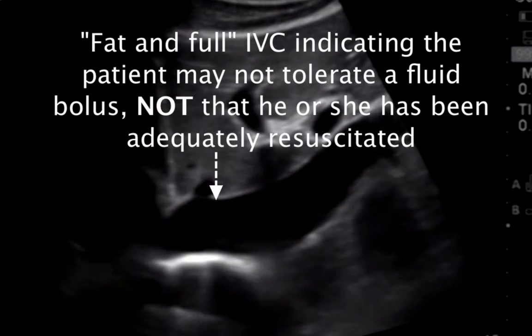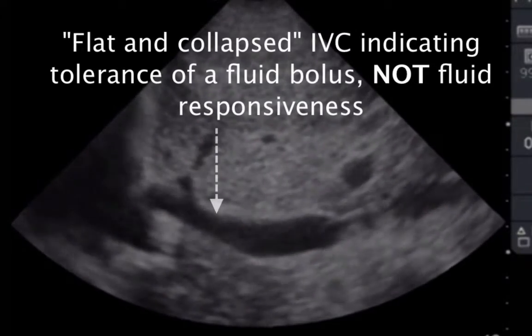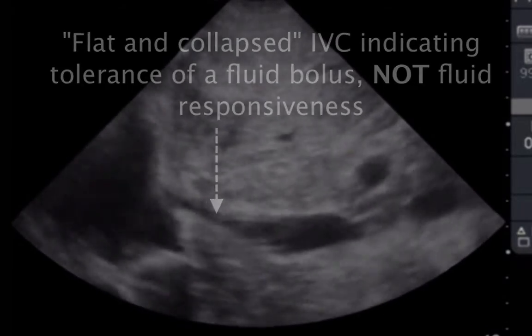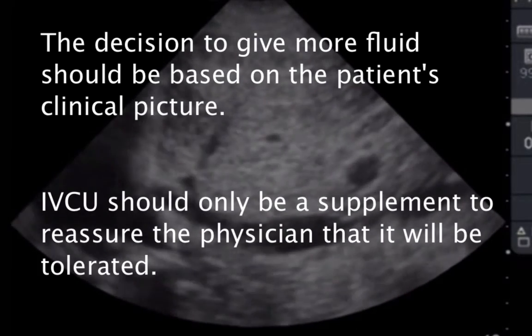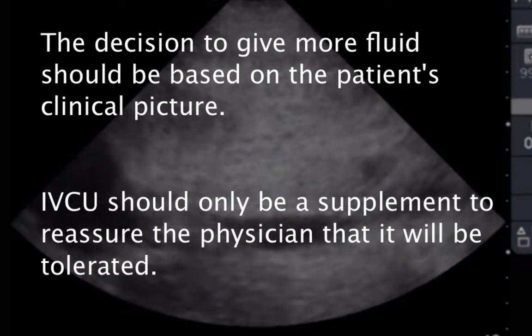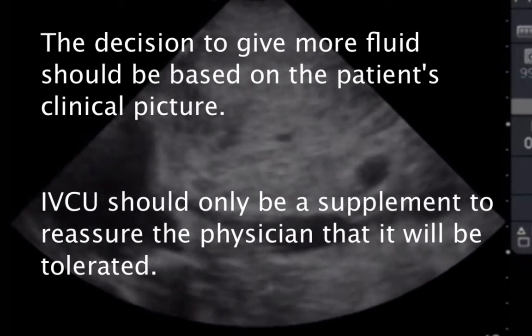Visualizing a full IVC with less than 30% respirophasic variation does not indicate that the patient is adequately resuscitated. Equally, a collapsing IVC does not imply that giving more fluid will result in a positive clinical response. It is most useful to predict whether or not additional fluid will result in fluid overload and iatrogenic pulmonary edema. The decision to give a fluid bolus should be based on a patient's vital signs, physical appearance, and overall clinical picture.